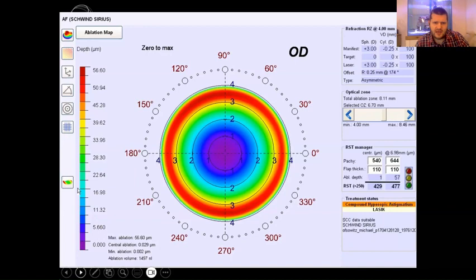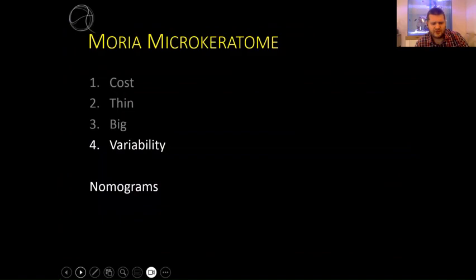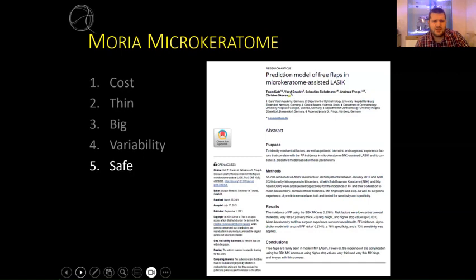You can also go quite big if you need to. I often do hyperopes - you can see quite a large hyperopic ablation. Note the size: 8.11 millimeters. Note where the red ring is here - that's exactly the same positioning, and you can see I've got ample space left on that more-than-eight millimeter ablation. I could have gone to a nine millimeter optical zone. I've got a lot of variability with the Moria microkeratome. I use three different nomograms. You can also adjust the speed and therefore adjust the depth. I had this publication from 2021.